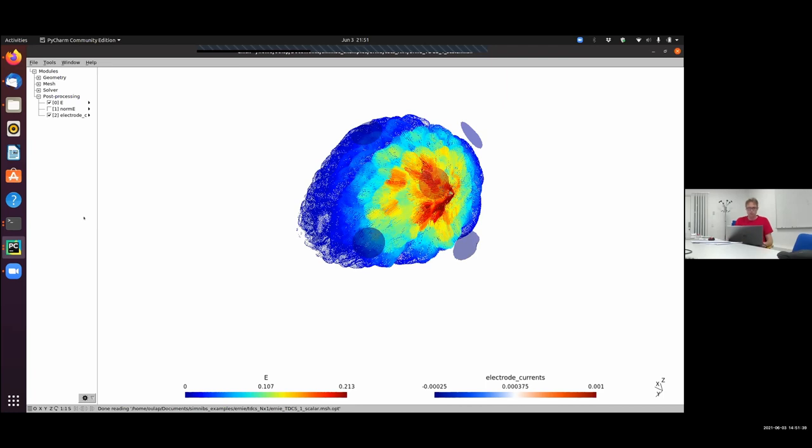Maximilian Lückel asks, how can one use the affine transformation matrix defining coil position and directions for neuronavigation with Localite? So the answer, I think, is twofold. At the moment, you can really just look at the last three numbers. It's a 4x4 matrix, right? And the last column gives the position of the coil center. This position you can at the moment just manually extract and use as a target entry for the Localite system, so that you get at least the position of your coil center correct. That's something you can do.